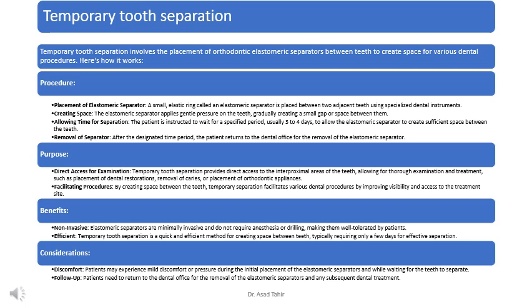Benefits. Non-invasive. Elastomeric separators are minimally invasive and do not require anesthesia or drilling, making them well tolerated by patients. Efficient. Temporary tooth separation is a quick and efficient method for creating space between teeth, typically requiring only a few days for effective separation. Considerations. Discomfort.